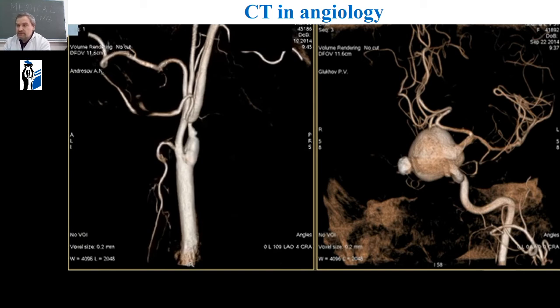In the left image, we see a vessel stenosis, and in the right image, we see a massive aneurysm. An aneurysm is a formidable condition. The aneurysm wall is often untenable. Its rupture is possible. We have just seen the movement of radiation diagnostics from guesswork, assumption, and intuition to direct anatomy.